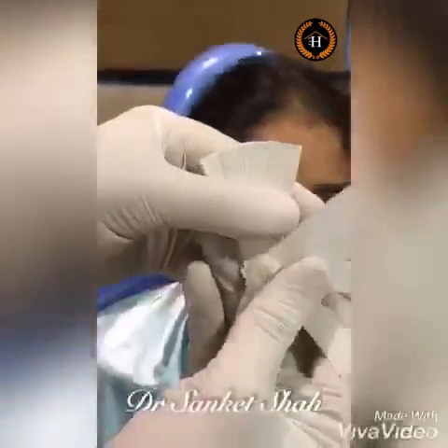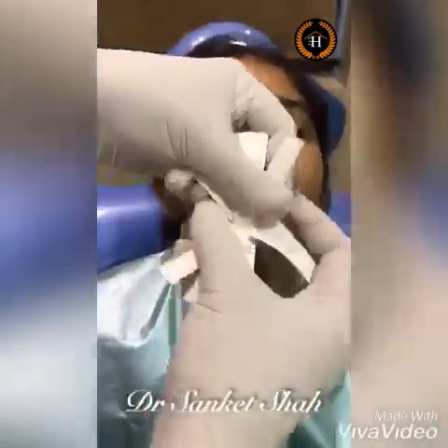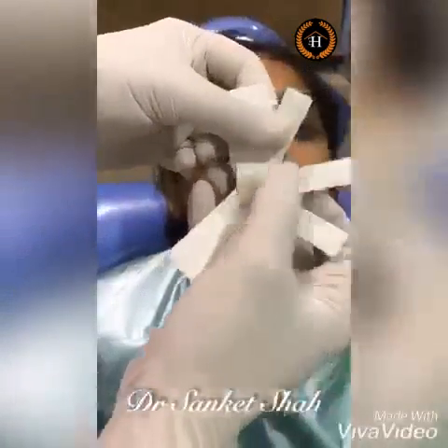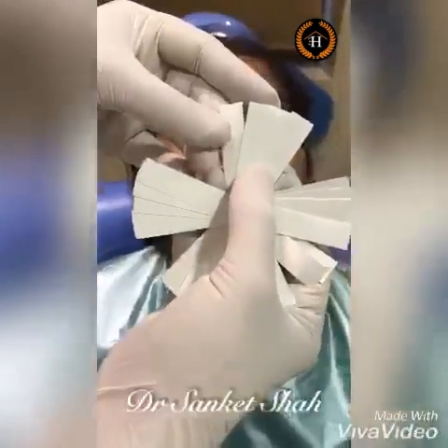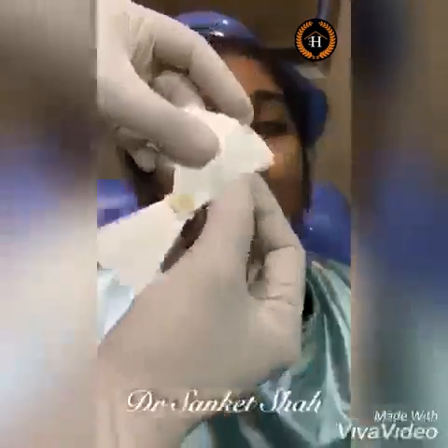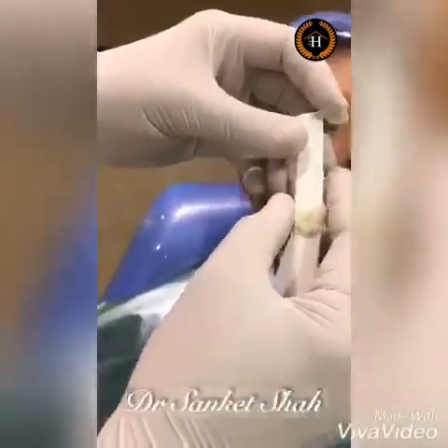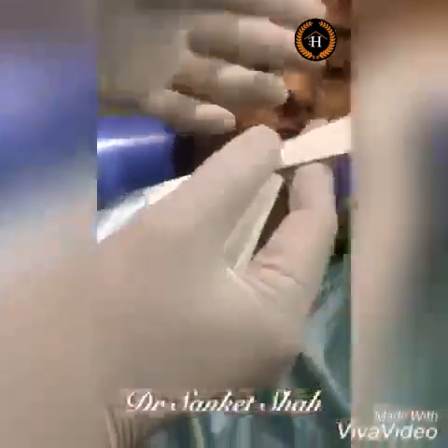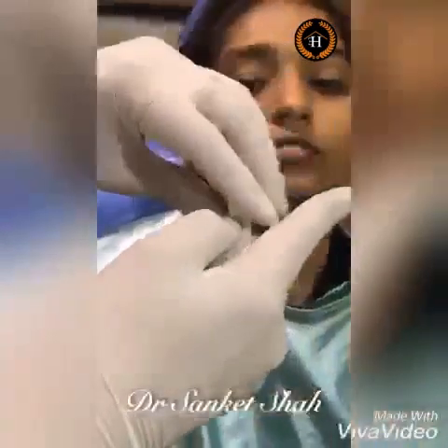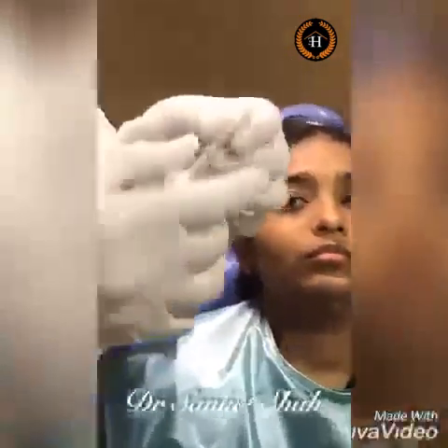Open please. Now I count the number of leaves: one, two, three, four, five, six, seven, eight, nine, ten, eleven, twelve, thirteen, sixteen, nineteen — approximately twenty-five leaves total. Eight leaves gives approximately one millimeter of disclusion. So with twenty-four or twenty-five leaves, I'm getting a disclusion of about three millimeters. I'm going to take a bite record material thickness of three millimeters.